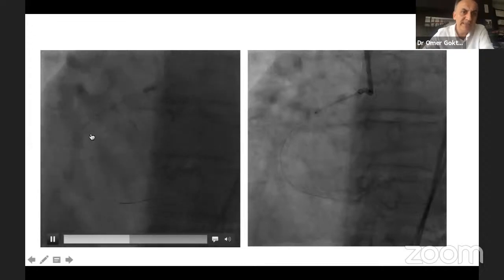If I put a stent over this retrograde wire, then I jail my own wire in the RCA, which is a terrible situation. In that case, this patient would actually have had to go to surgery, because I would jail my retrograde wire. So this is a very bad situation. We shouldn't have this. So I remove the microcatheter and also the retrograde wire here.